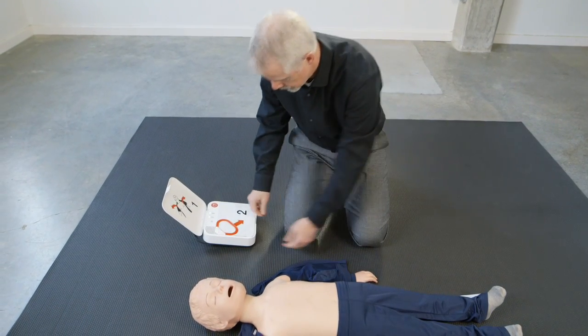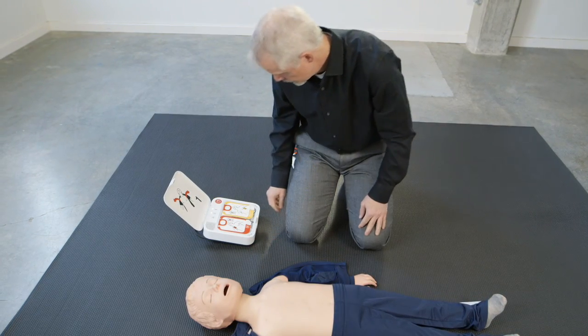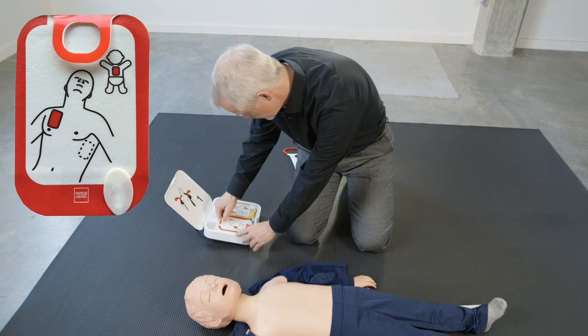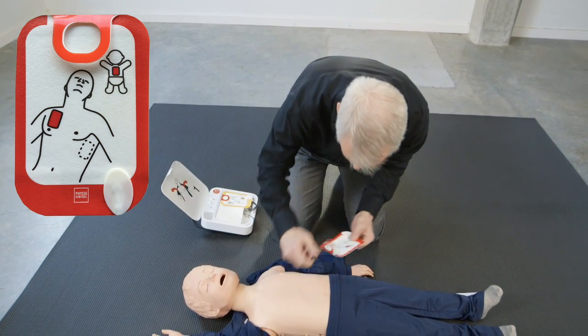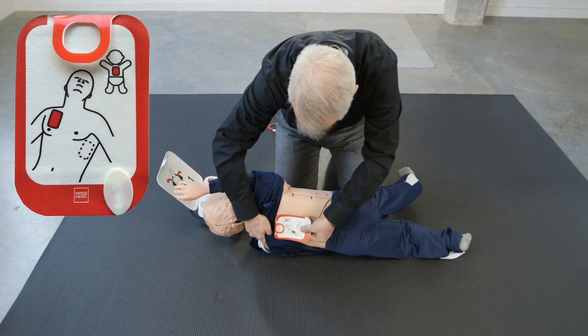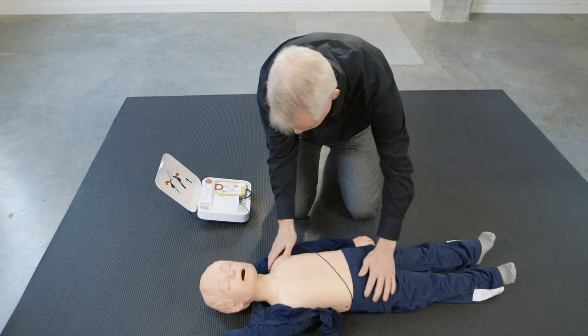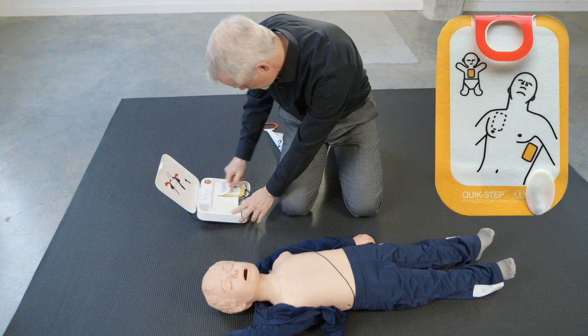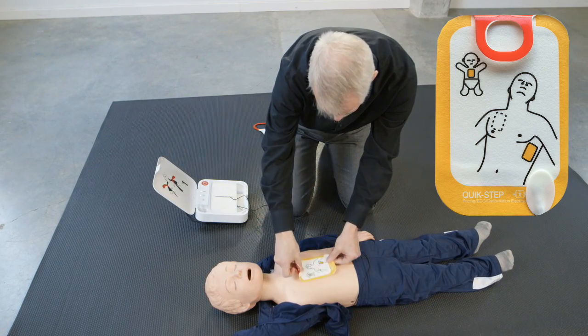Pull red handle to reveal pads. Look at pictures on pads. Apply pads to bare skin exactly as shown in the pictures. Press pads firmly.